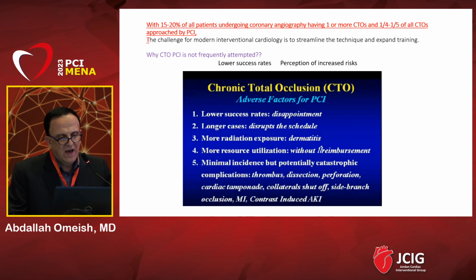Why the CTO PCI is not frequently attempted? Because of lower success rates and the perception of increased risks. The adverse factors are lower success rates, longer cases, more radiation exposure, more resource utilization, and the incidence of potentially catastrophic complications.